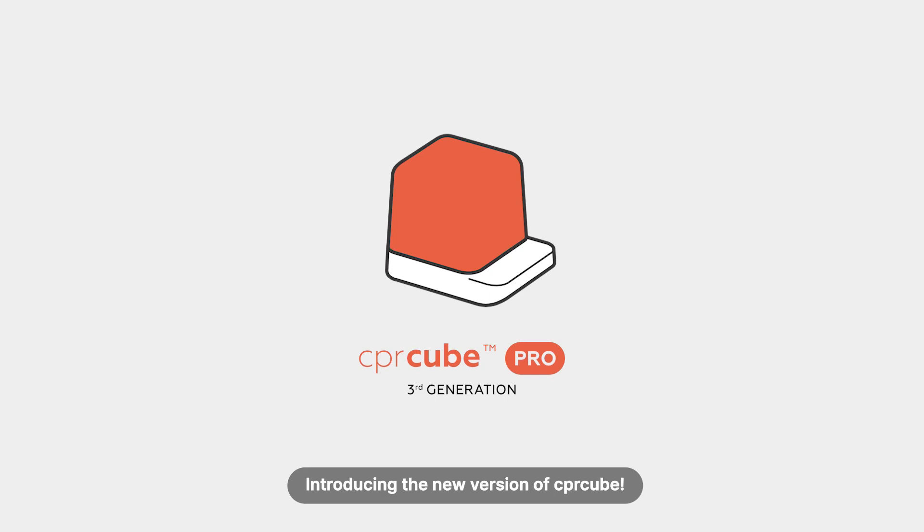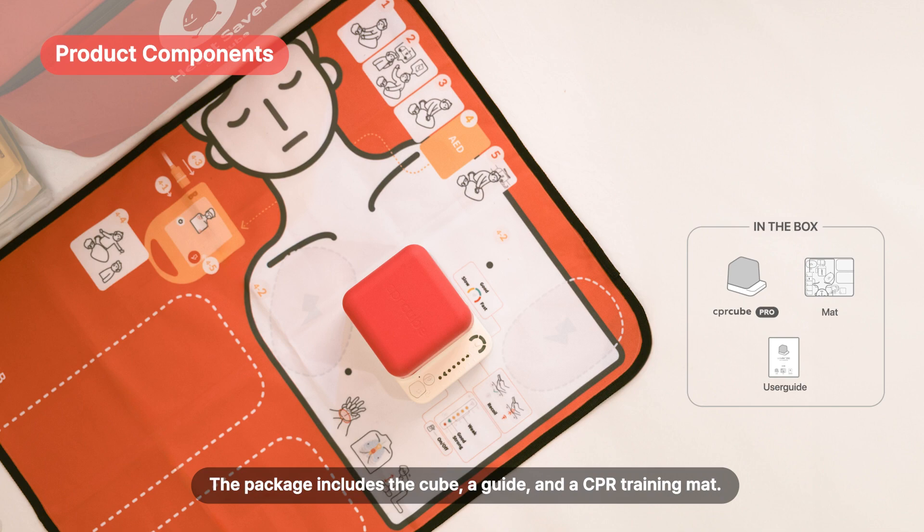Introducing the new version of CPR Cube. The package includes the cube, a guide, and a CPR training mat.